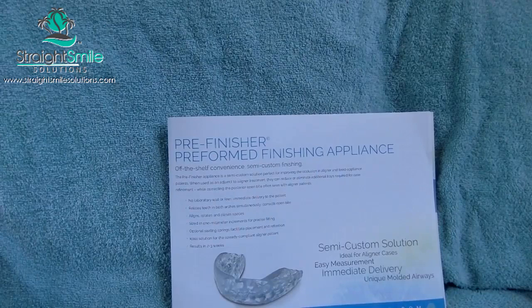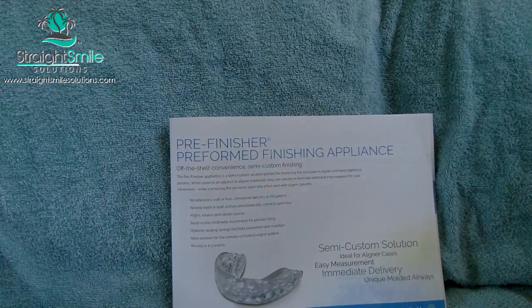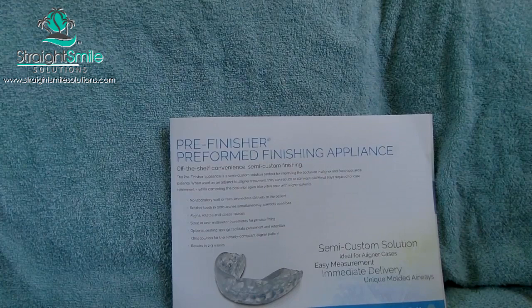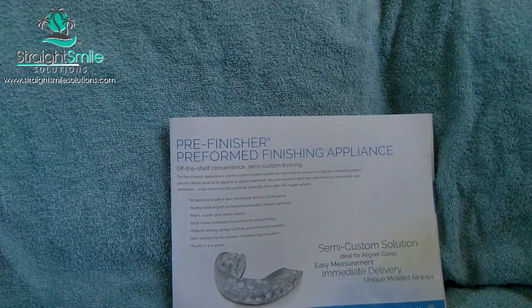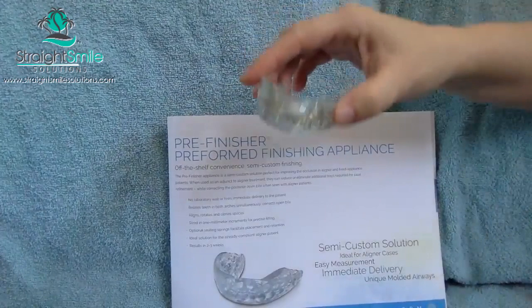Today we're going to talk about positioners. I see so many companies launching their own version, so I want to compare TP Orthodontics positioners with others on the market. They sent me an entire box of all their sizes and I had a lot of fun playing with it — it was super easy to measure. They sent a little ruler and I found the right size for me. My son is actually a patient of Healthy Start by Orthotain — he went all the way through the process, so he won't need braces.